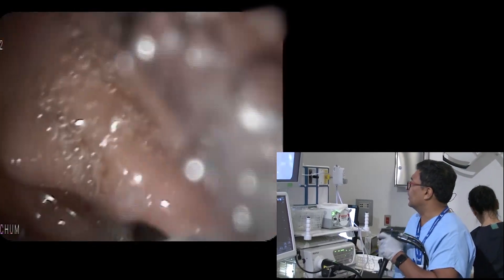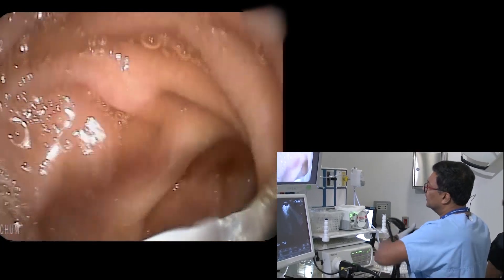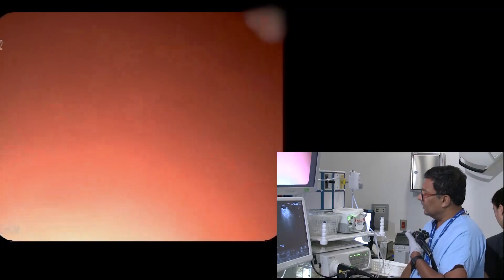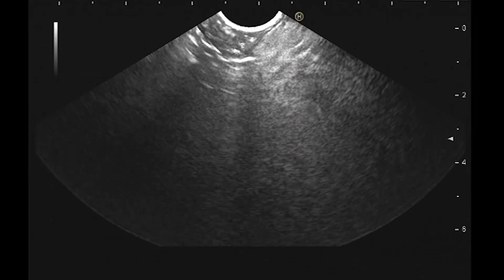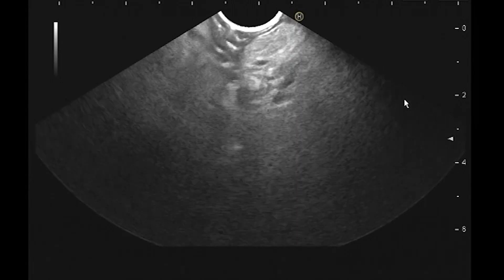I'm going to go right into D2 actually. Come back. And then we'll see if the head looks — see that the head of the pancreas looks like normal pancreas. So that means what's going on at the genu there is totally abnormal.